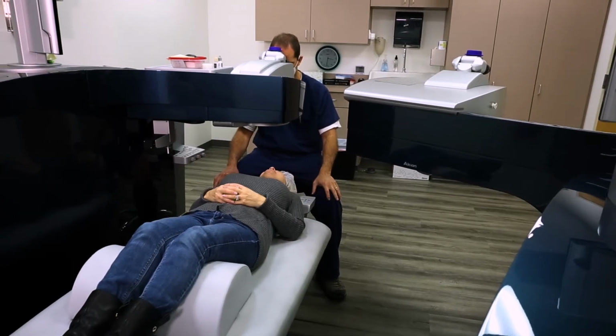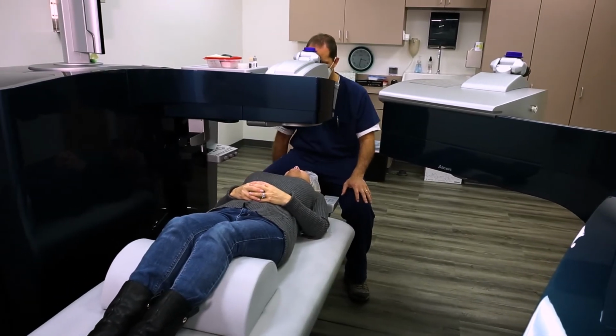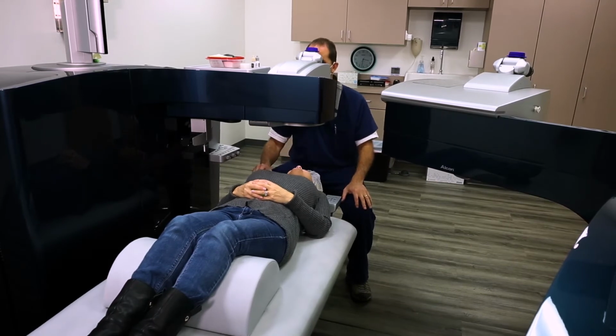I'm going to walk you through each step of the process, and it's going to go faster if you hold still, so try not to move your head or your feet. The anesthetic drops will be placed in your eyes just before you start, so you won't feel any pain during the procedure, but you may feel a mild pressure. If there is any discomfort, let me know and I'll do everything I can to alleviate it.